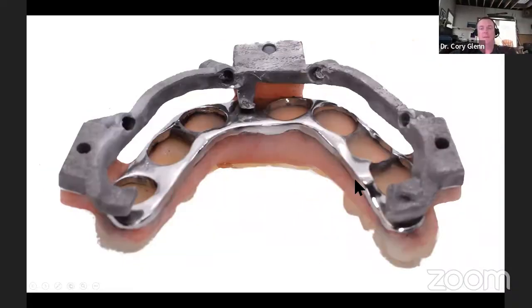And the cool thing is that since it is bonded ahead of time, once it's in there, I can actually polish this thing up to a mirror finish, which gives a very nice surface for your tissue to sit against. It will develop great contours and everything, and all you'll have to contour is the bottom side and basically taper it into your cylinder with a nice smooth transition where you pick your cylinders up.